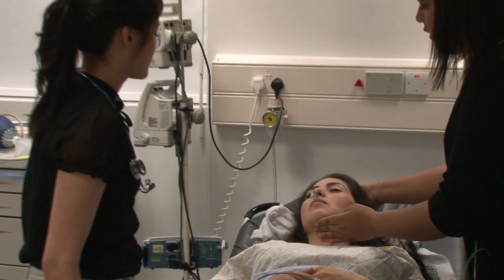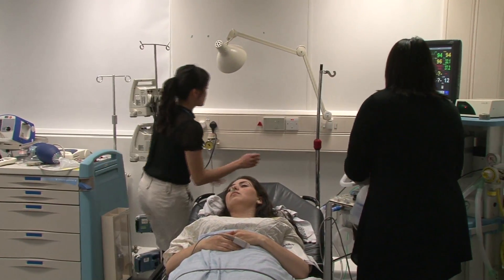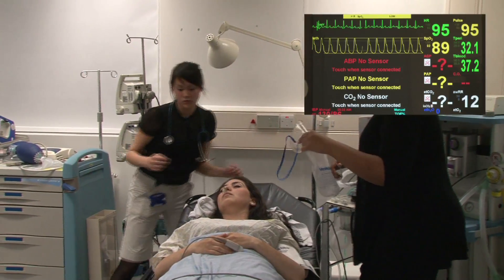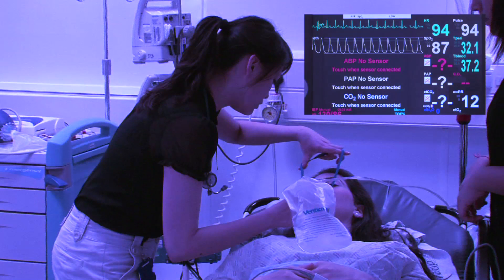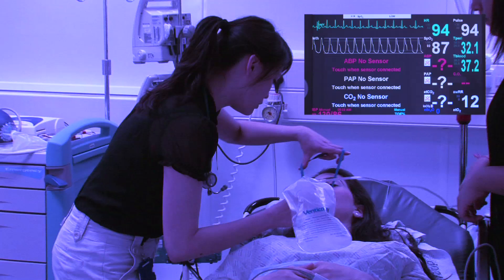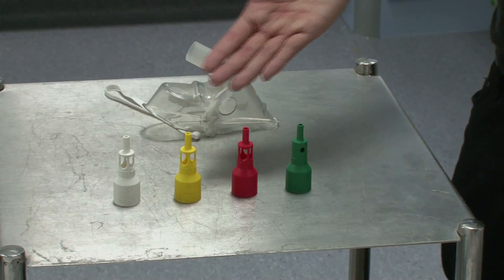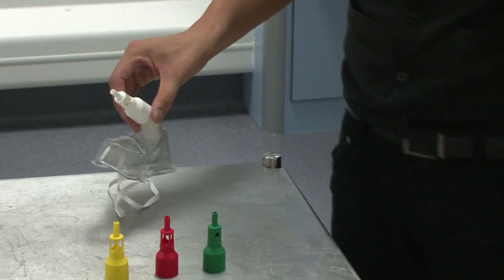I'm just going to move your head back to have a good look. The airway seems patent now, but it looks like the stats are dropping. Can you pass me the non-rebreather? Our patient's oxygen saturations are 87% on room air. For this reason, an oxygen mask with reservoir bag using a flow rate of 15 litres per minute is most appropriate. In patients who are not critically ill or are carbon dioxide retainers, a venturi mask is more appropriate. A low-concentration venturi valve should be selected first and then titrated upwards to achieve desired oxygen saturations — these are 94–98% for most patients, or 88–92% for carbon dioxide retainers. The valves are colour coded. Attach the valve to the oxygen mask and then attach this to the oxygen tubing.